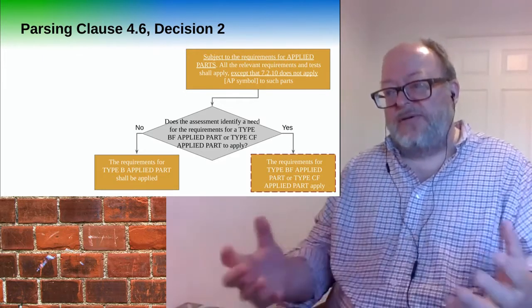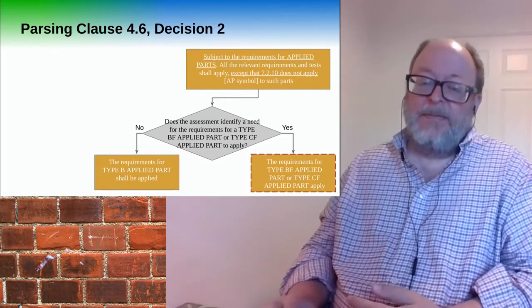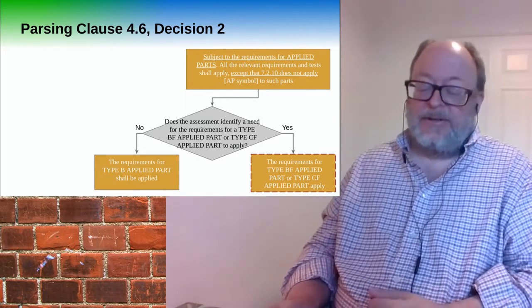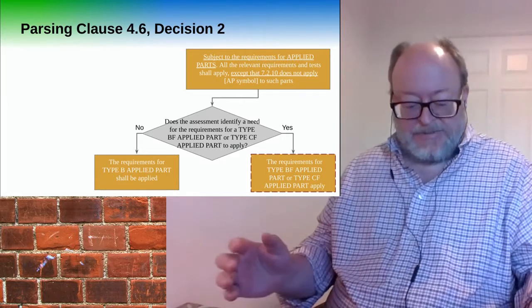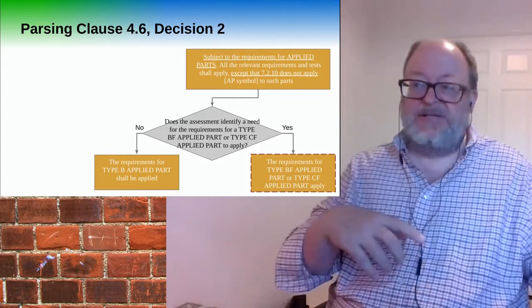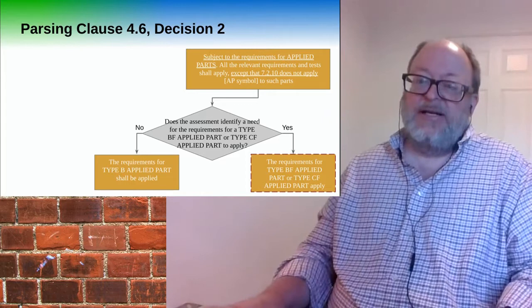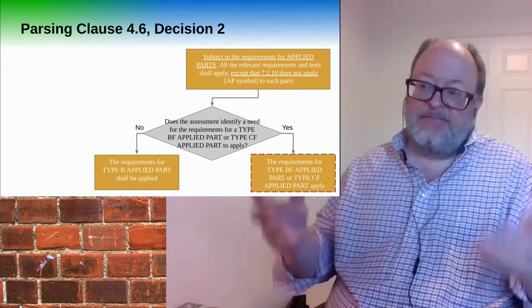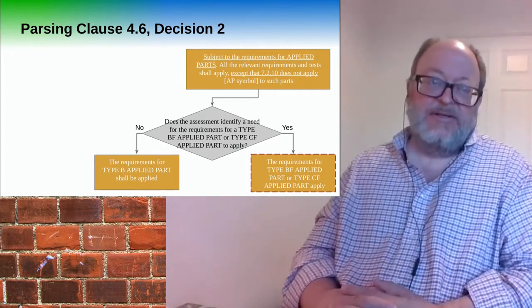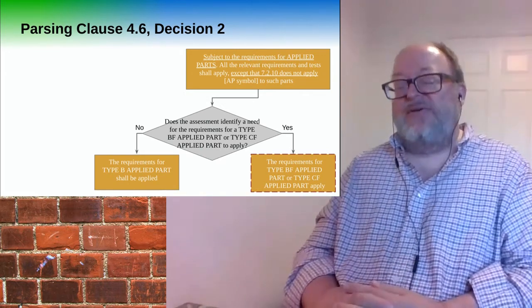The standard's unclear, but there is rationale. If I think about experience with manufacturers, a lot of devices today are based on old legacy devices, and so the design doesn't change much. Recall that we didn't really use the third edition until about 2010. It's only 10 years ago.